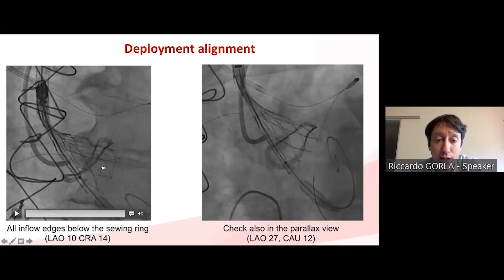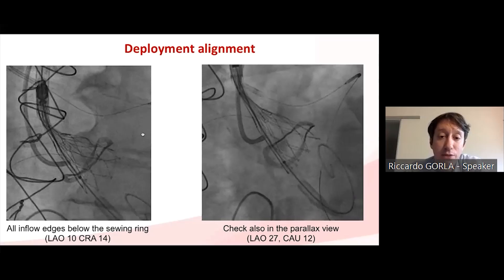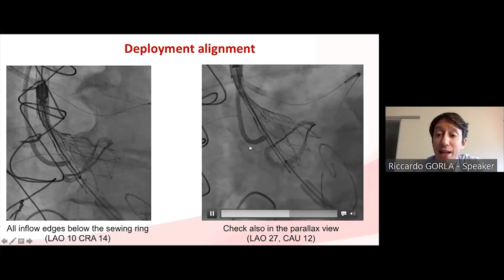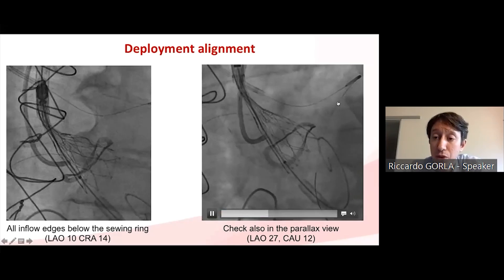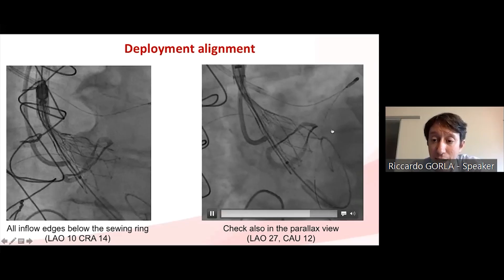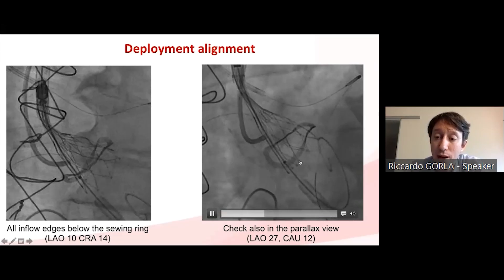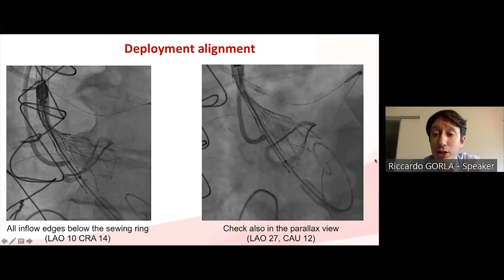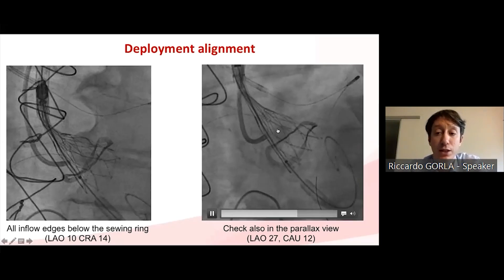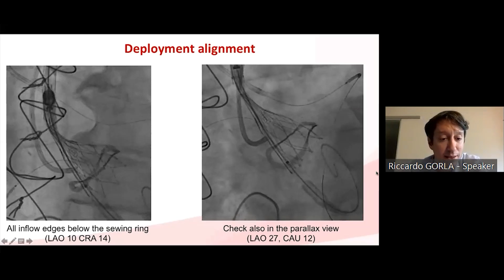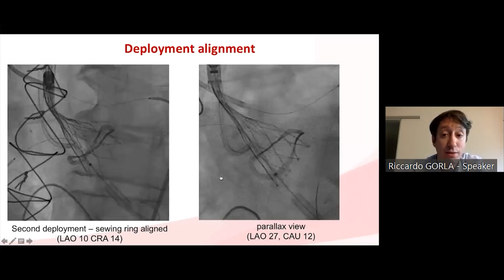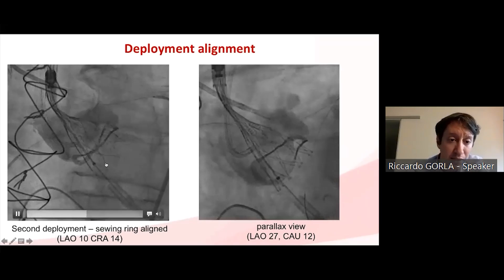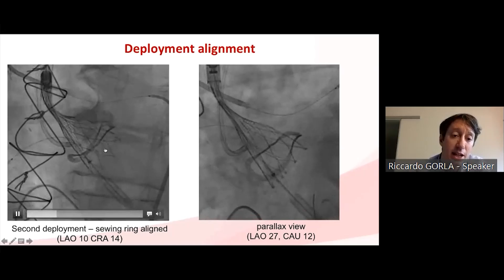Before completing the release, check that all inflow edges are below the sewing ring of the prosthesis — this is a sign of safety. If in doubt, check in another projection, such as the parallax view. In this case, we could see at least one stent strut near the sewing ring, so we were not confident and decided to recapture the valve and attempt a slightly deeper implantation.